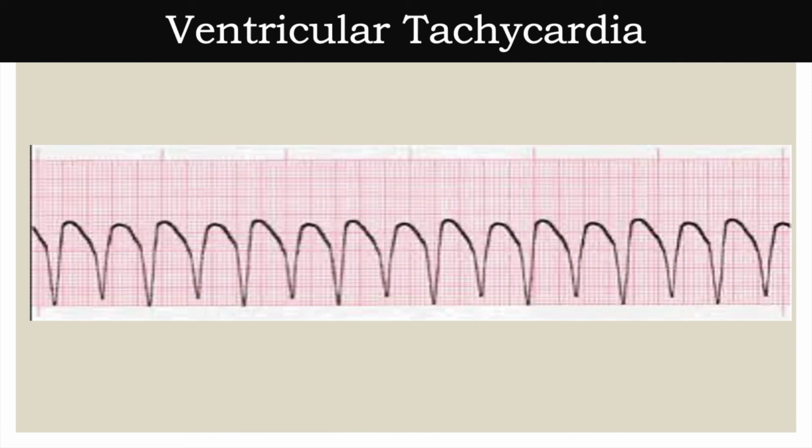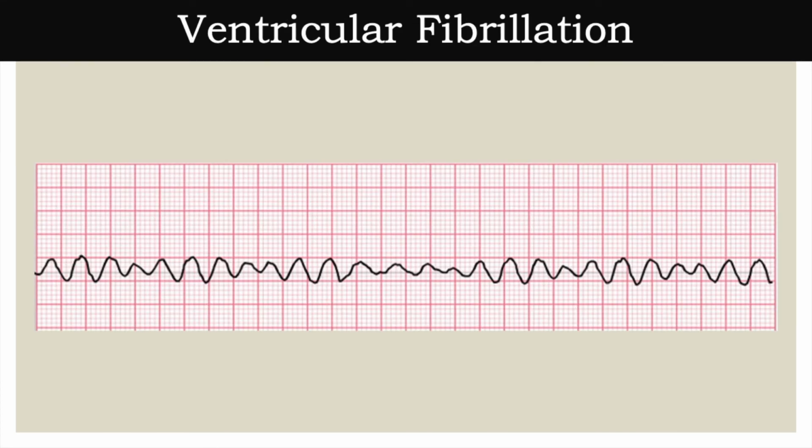So the ventricular issues are super easy. You either have a pulse and you cardiovert, and then if you don't, then you do CPR and you defib. So it's pretty basic and simple. I love the ventricles because they're that easy to do. So now for ventricular fibrillation, it looks like this. I don't even know what it looks like, but it's basically that your ventricles are quivering.